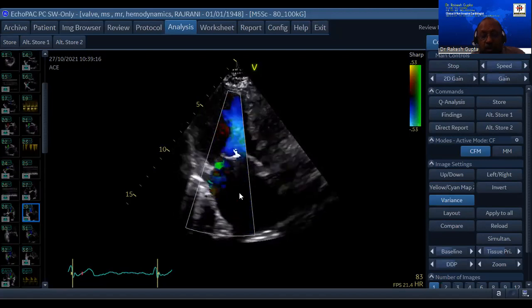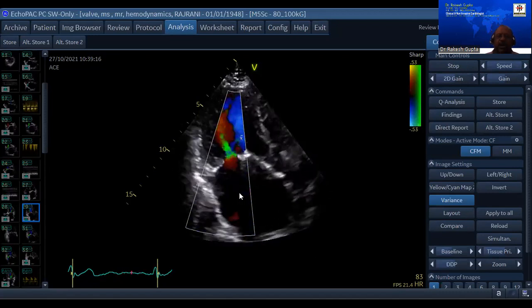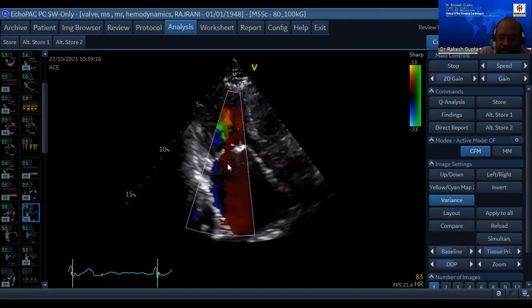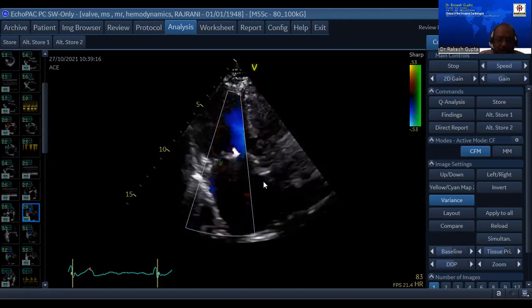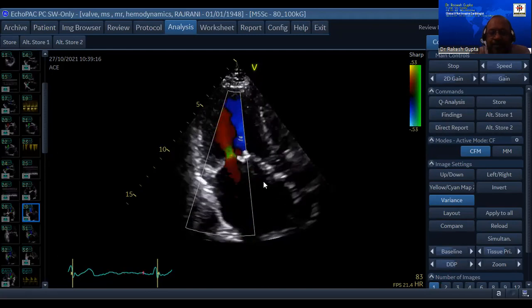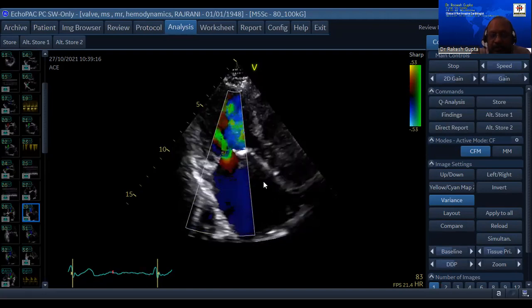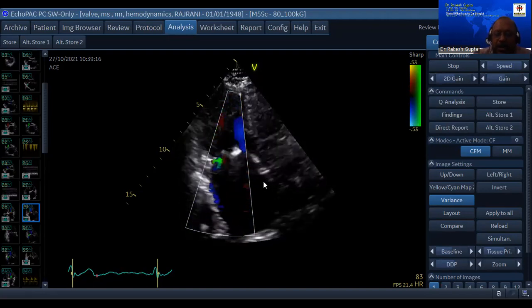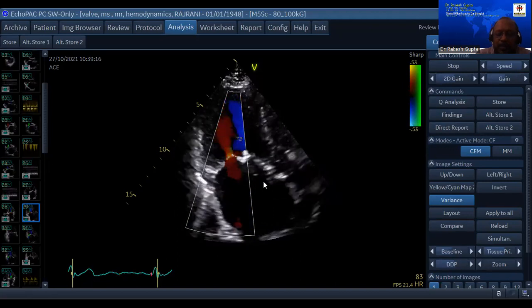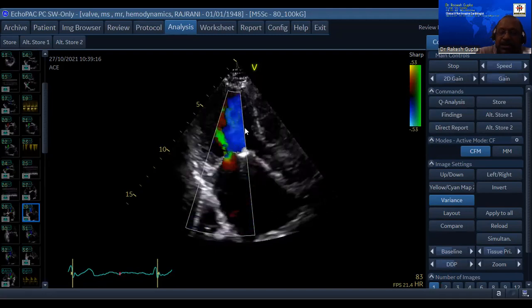And that's why we do not put a lot of emphasis on it. If you ask me how to look for mitral regurgitation, believe my words, I'll never ever look at the MR jet area versus LA area. In my class, when I'm talking of level 2 or level 3, I'll talk of vena contracta, LV dimensions, then regurgitant volumes, and then the PISA method, which I'll employ in these sort of populations. What you can do in this population, suppose you do not have any mitral stenosis, I gave you that one answer, mitral aortic velocity integral ratio, MAVIR.